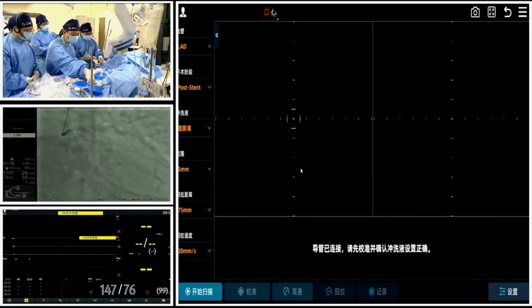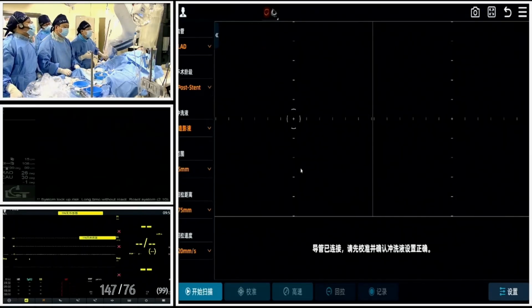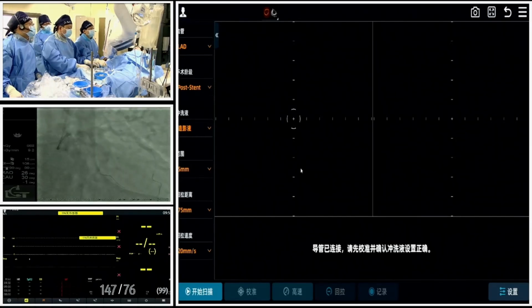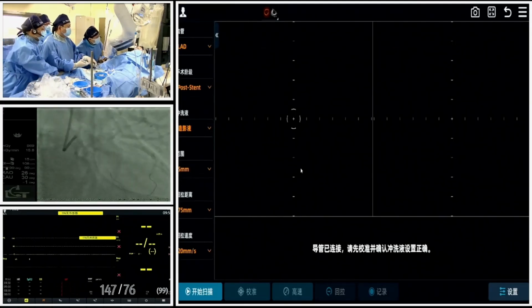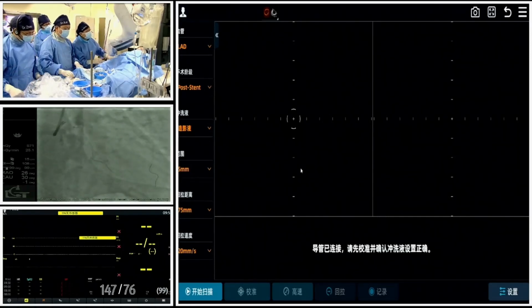For conventional KBI, it should lead to deformation of the left main distal portion. So with the conventional KBI, the stent could be deformed. Yeah. But with the modified approach, it should be well protected. The risk of deformity is not that high.